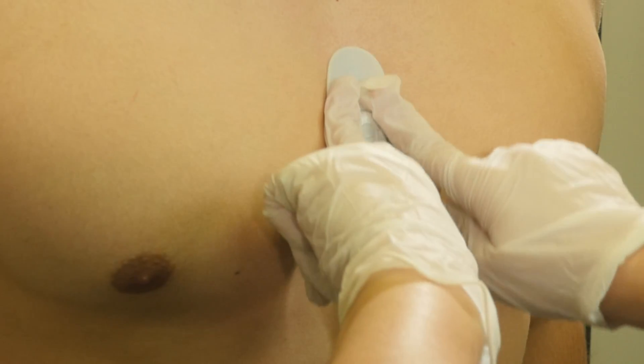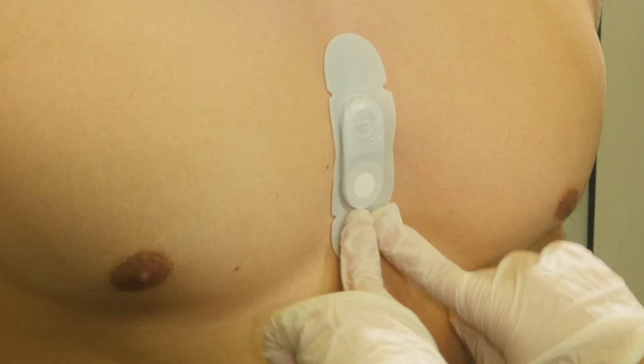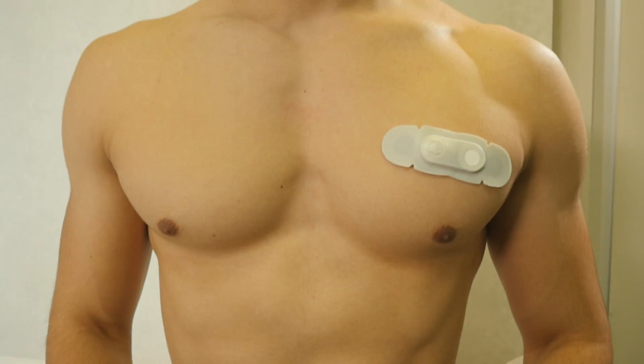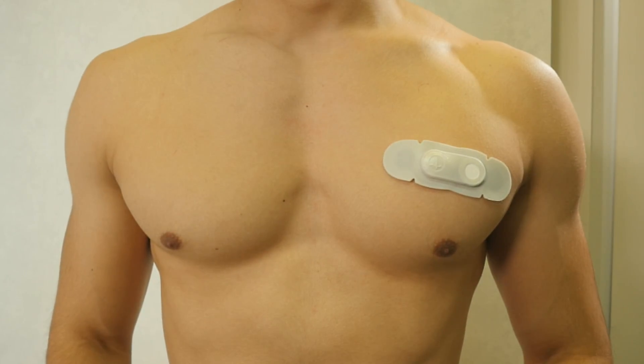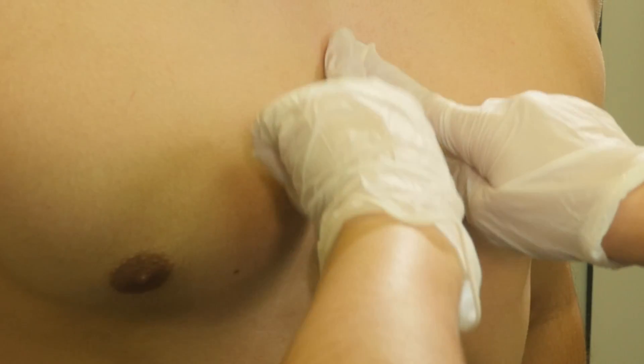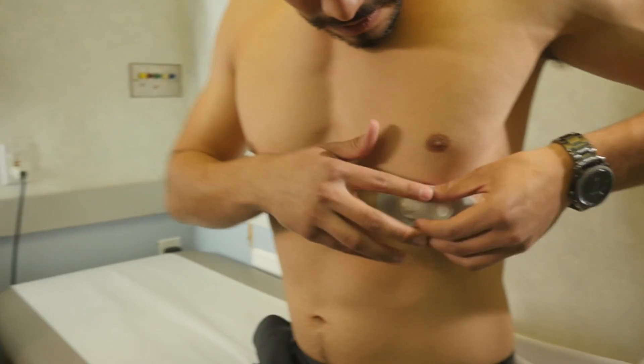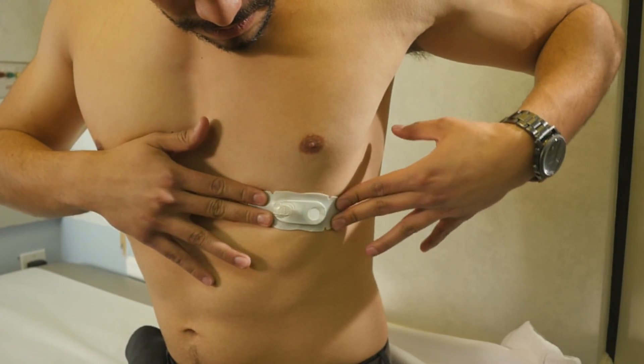Applying the Patch. The CV strip should be applied to one of these three locations: upper left chest at a 45 degree angle, center of the chest above the sternum, or under the left chest on the ribcage.